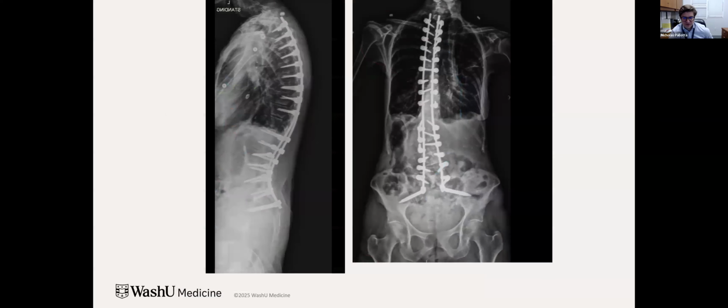This is maybe an answer to Dr. Goodwin's question. This spine, I would say, globally was very close in terms of coronal alignment. But in terms of the scoliosis, it was still quite a bit off. And so I just sequentially and slowly reduced from the fractional curve up. And actually, though these rods didn't lay right in as you described, the correction came back all the way.